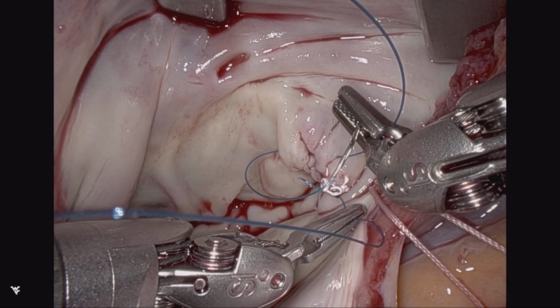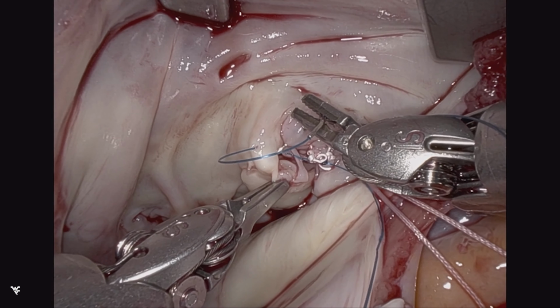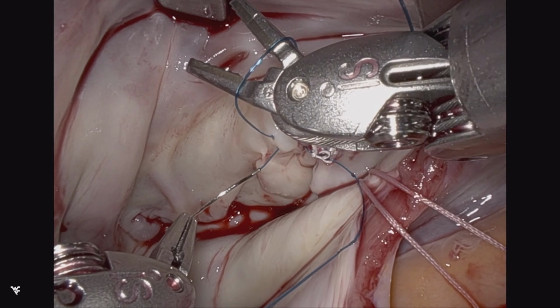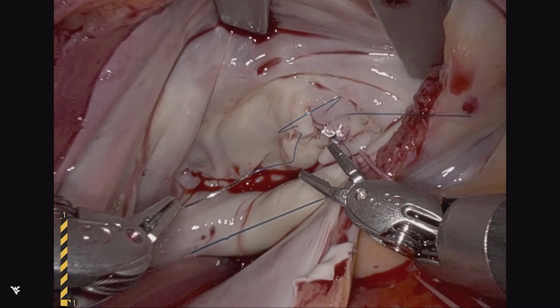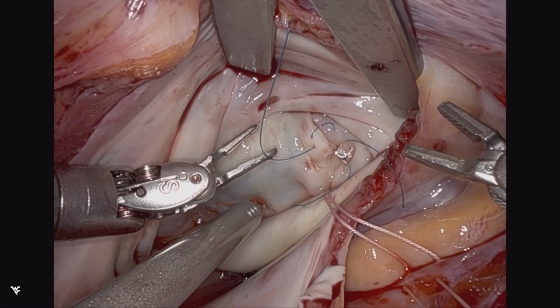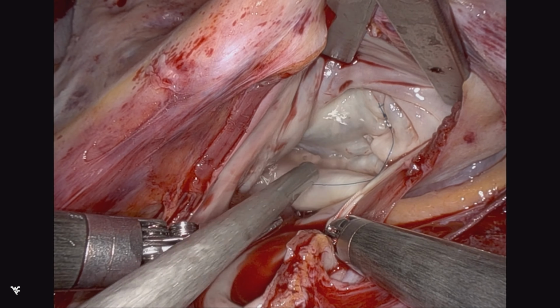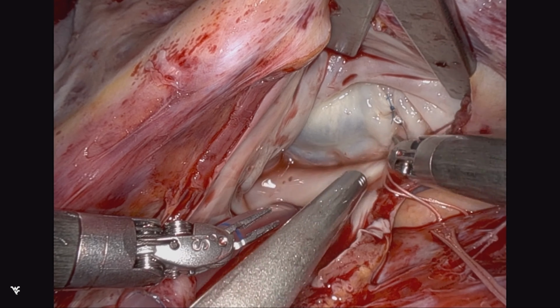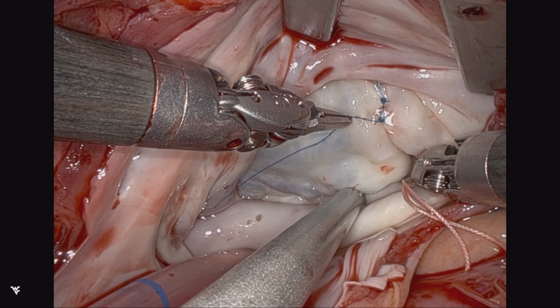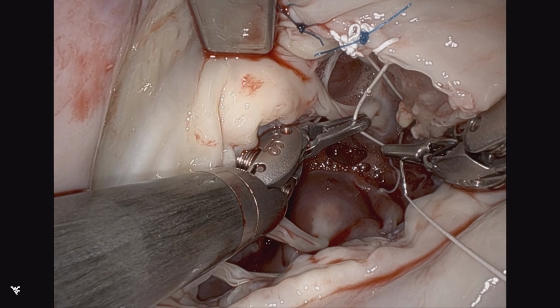In this situation, an abbreviated commissuroplasty with a single stitch is performed. And this is a simple figure of 8 done under pressurization so as not to make this too narrow. You can see this is nearly at the level of the annulus. And we've got the majority of the valve already repaired with one cord and that minor commissuroplasty. But you can see there's still some prolapse and tissue loss at the level of the proper P3.